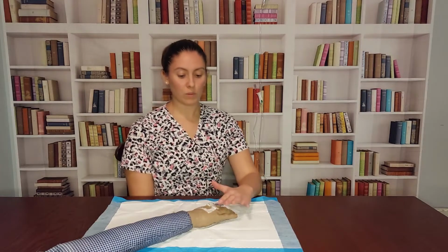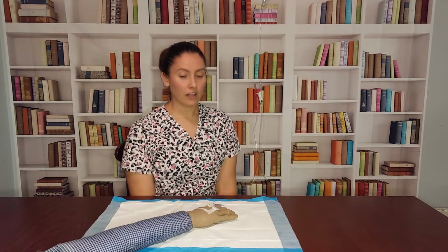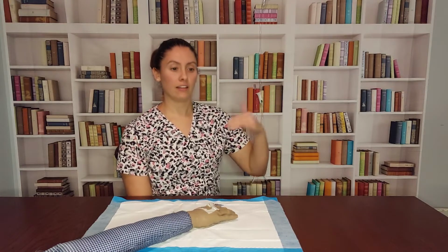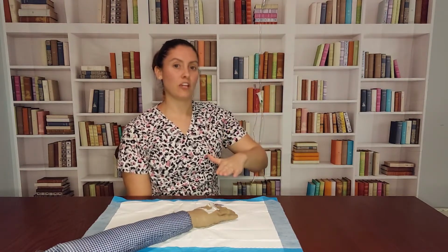We would always put in the IV for the patient, but sometimes if the family feels comfortable, we can teach them how to actually run the gravity bag. So in this video, that is exactly what I am showing you how to do: run it by gravity. A gravity bag works by hanging it higher than the patient, so gravity actually pulls the fluid down into the patient.